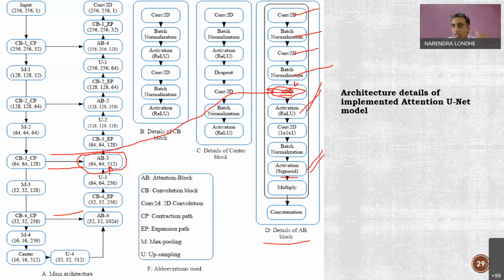Say that before the softmax layer there is a convolutional layer, like in FCN, which I just described. So there will be a fully convolutional network, and that will be a huge matrix. Instead of handling all the values of the matrix, why not calculate some simple probability values by using the softmax? Softmax is nothing but one probability function.